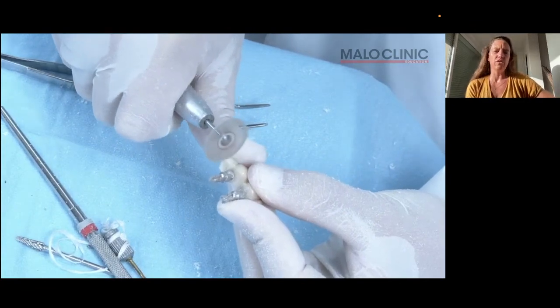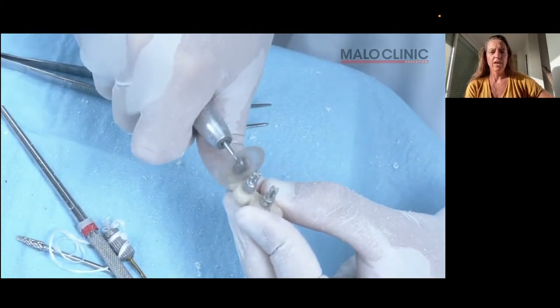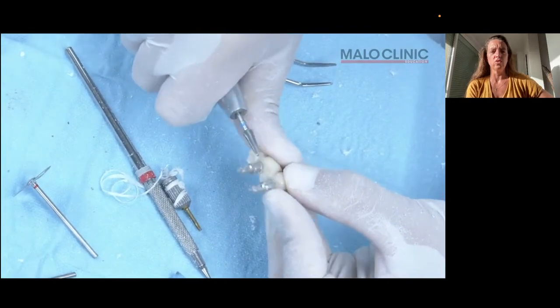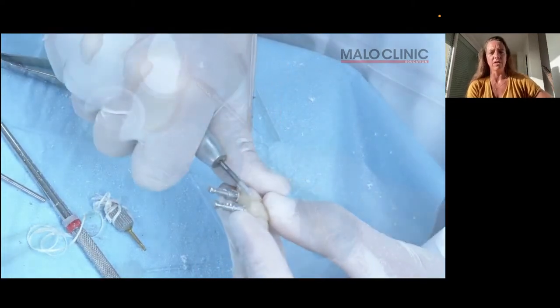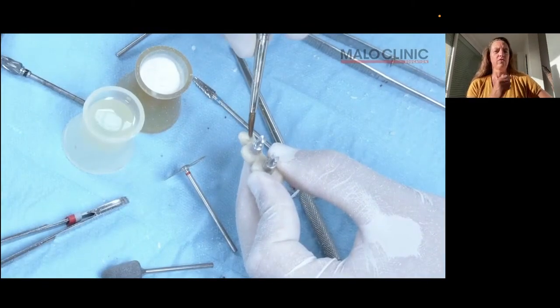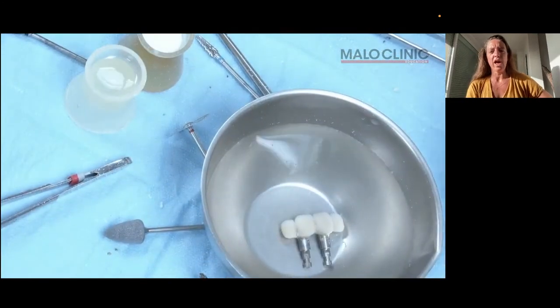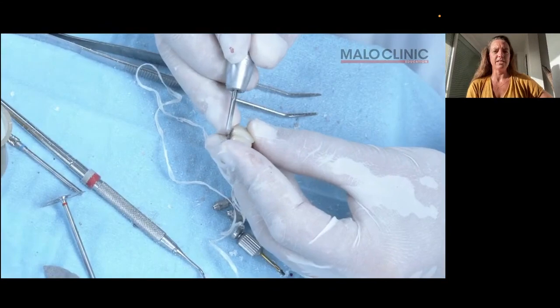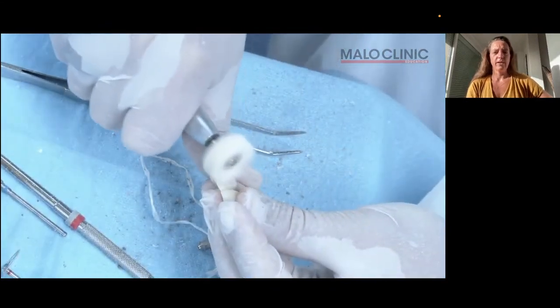So as you can see, if you plan this, and this is planned in an analogic way, it's very easy to do it chair side, and very easy to have everything prepared and planned for a case where you have this missing of the 4 anterior incisors.